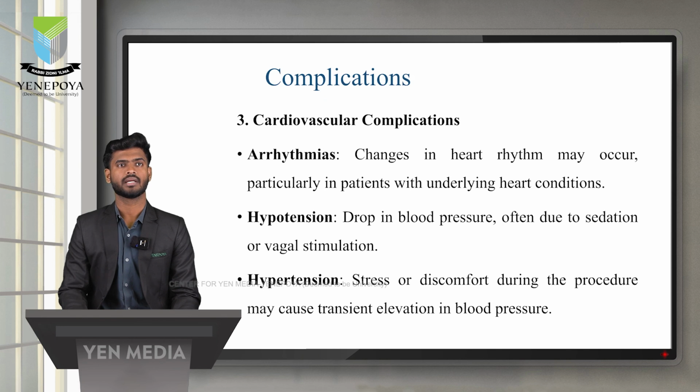The third are cardiovascular complications. Arrhythmias, changes in heart rhythm, may occur, particularly in patients with underlying heart conditions. Drop in blood pressure is often due to sedation or vagal stimulation. Hypertension: a patient having stress or discomfort during the procedure may have a transient elevation of pressure.